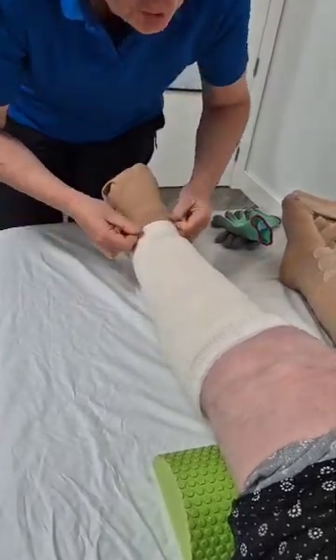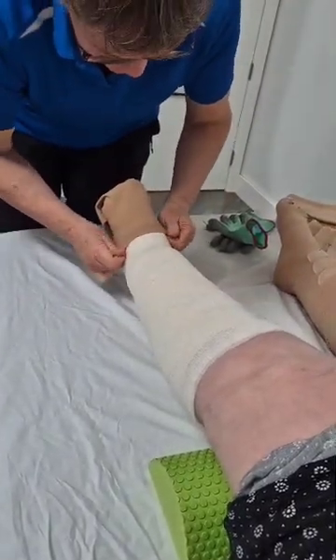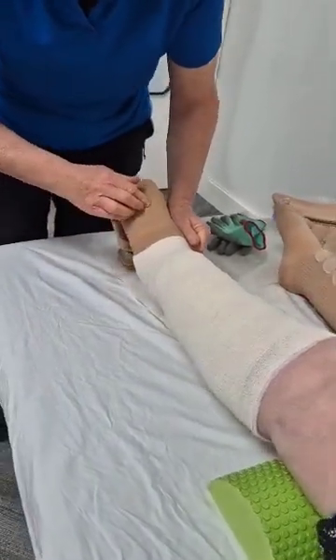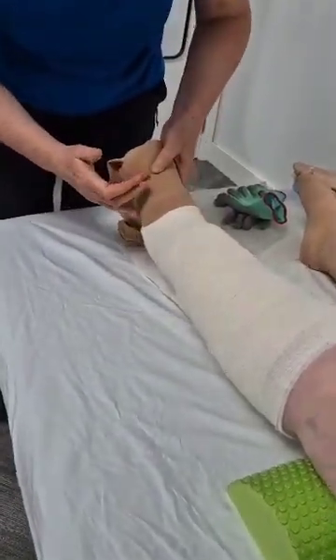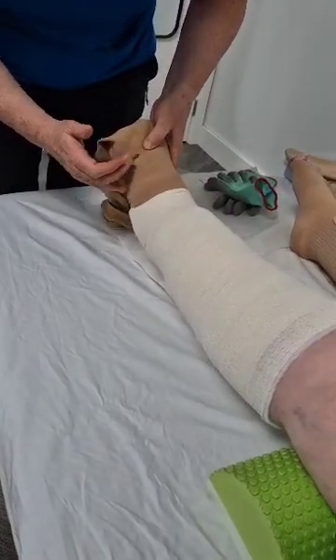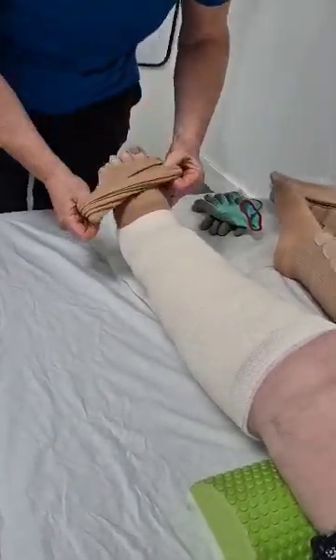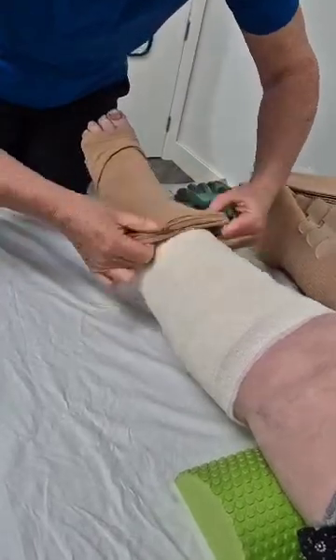Trying not to take your toenail off. Oh, I should have cut them actually. No, you're right. Okay, so there we are, and I feel that on the inside we've got pressure sitting at about the base of the toes. And then we take the garment and open that up once again, slip it around behind the heel.